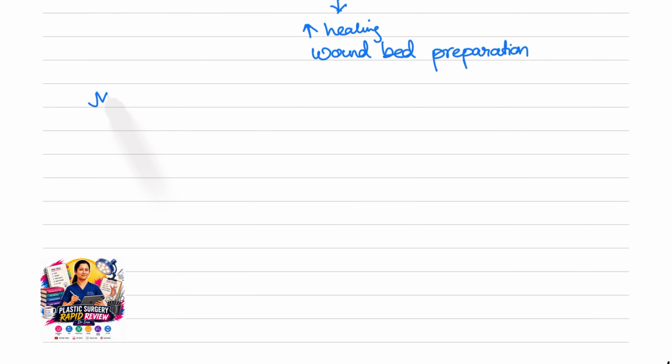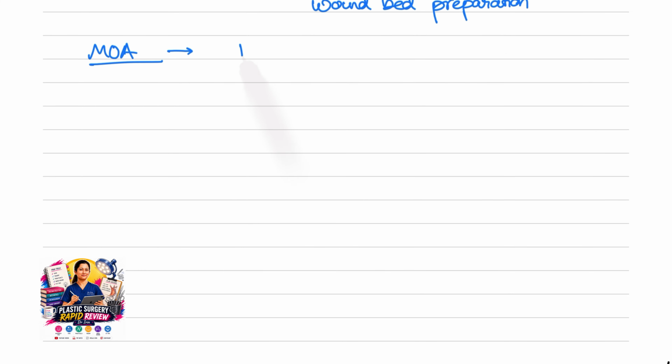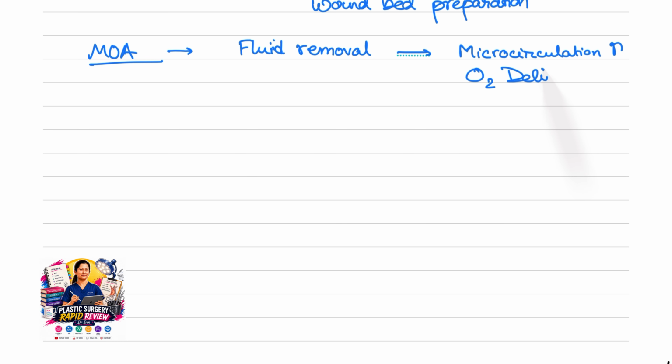So, what is the mechanism of action? First, being the fluid removal. It removes excess interstitial fluid, which improves microcirculation, oxygen delivery, removes toxins, inflammatory mediators, and proteolytic enzymes, and decreases edema.